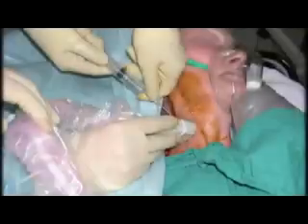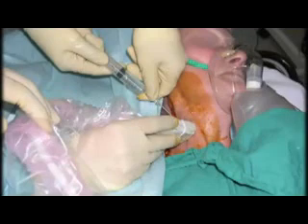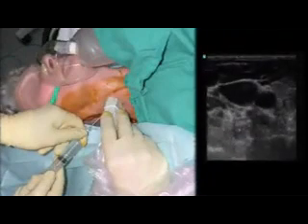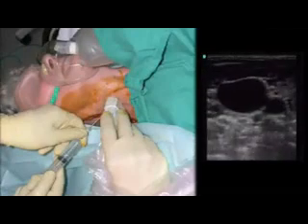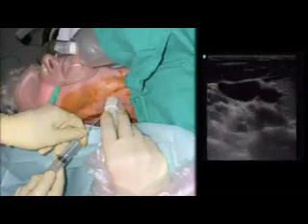Veins may collapse completely and may be difficult to identify if a patient is upright or semi-upright. Placing the target vein in a dependent position and having the patient perform a Valsalva maneuver may dramatically increase the size of central veins and makes identification and cannulation much easier.